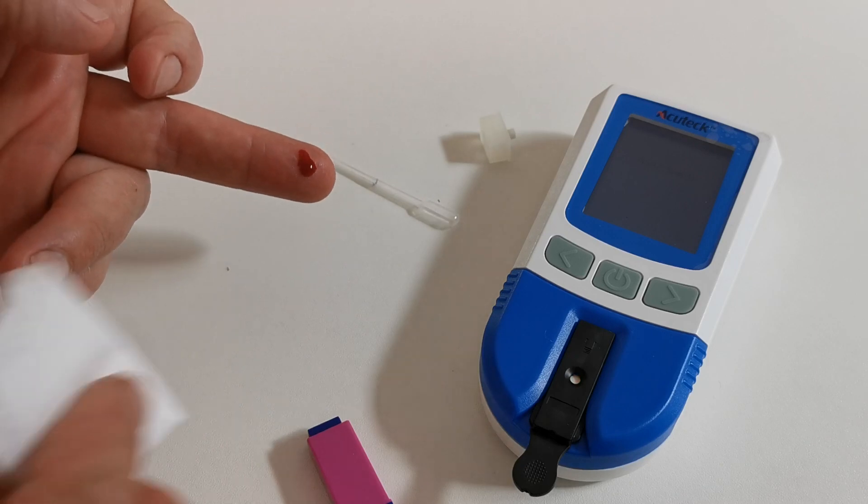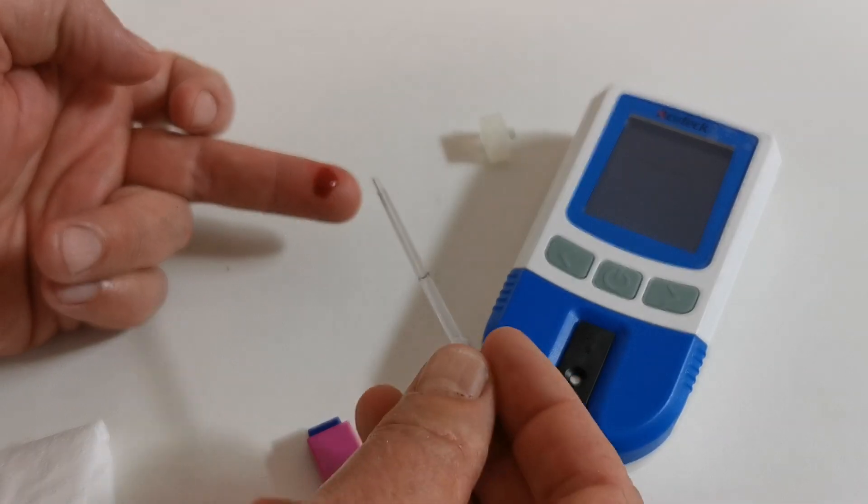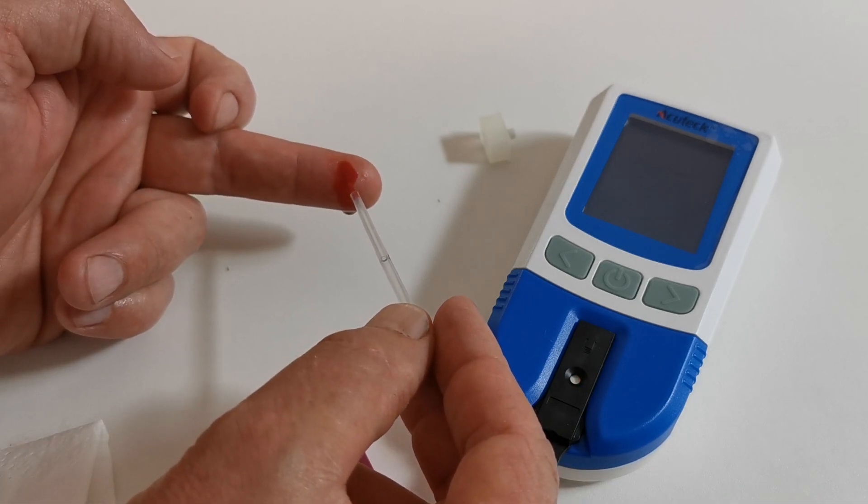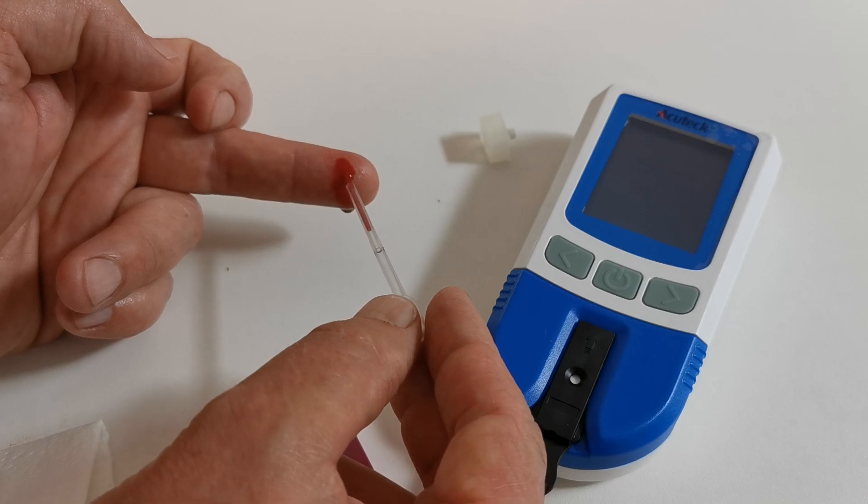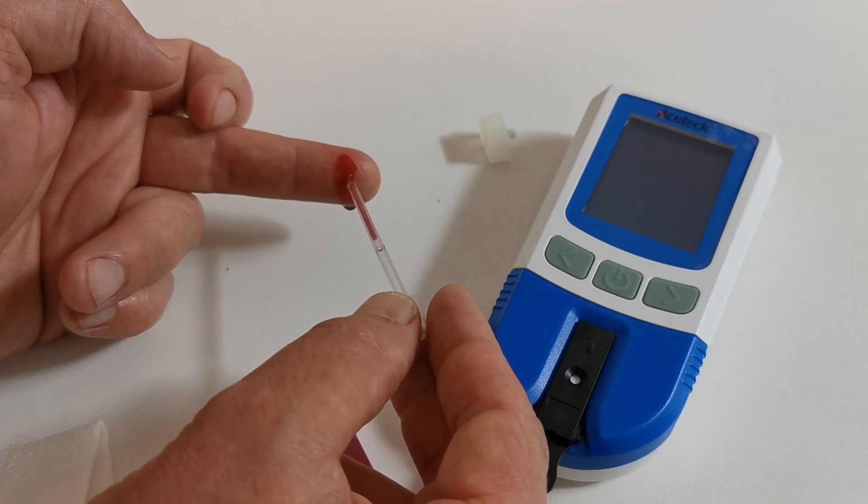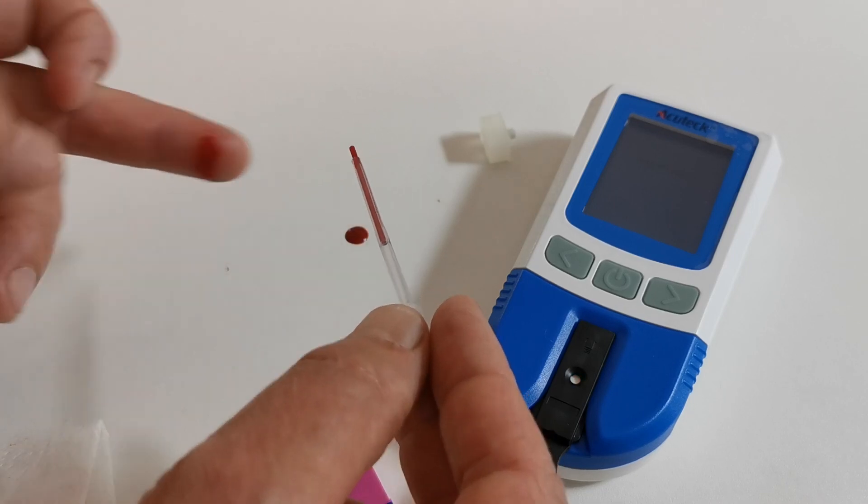The first droplet will form naturally. Wipe it away. The second droplet will form very quickly. Use the pipette, placing it into the blood sample. You're not squeezing the pipette bulb at all. It will naturally feed itself along until it reaches that black line, which is the indicator of the blood volume required.